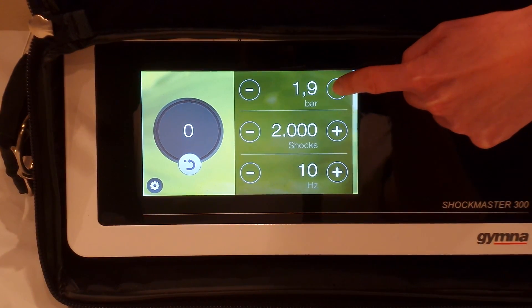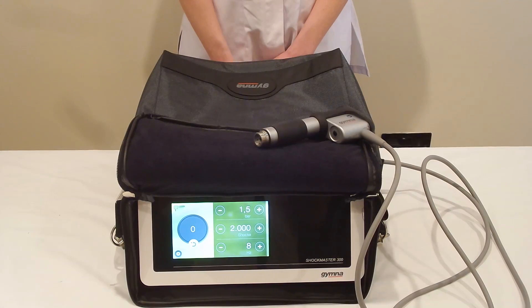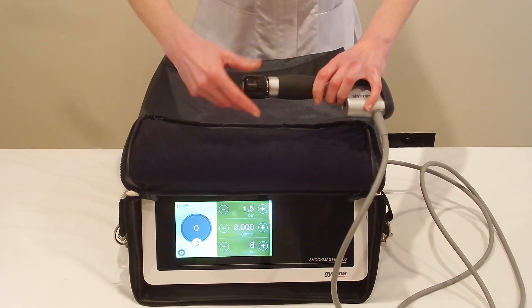This is treatment to the plantar fascia where the pain is across the whole of the plantar fascia, not just at the proximal aspect. We've gone to 2 bar at 15 hertz and we're going to be using the larger 20 millimeter applicator head for this treatment.